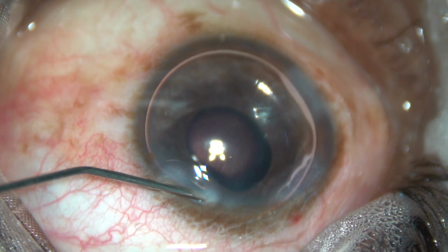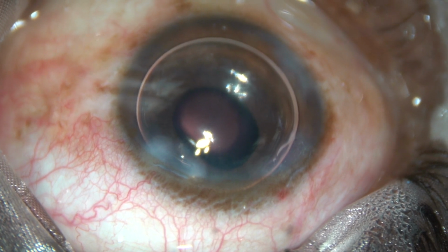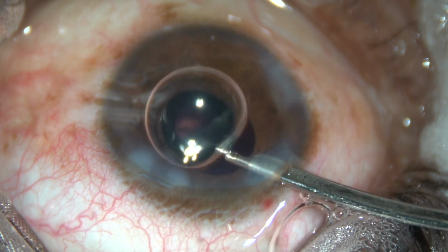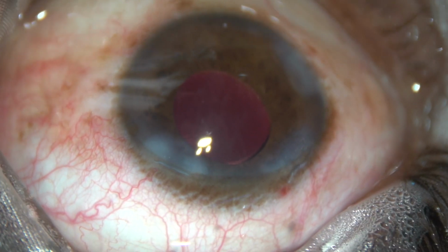Now these side ports are hydrated nicely. Final lavage of the anterior chamber is done and the case is concluded. Thank you very much. Hope this video will help you in developing your surgical skills, will help you in managing PC rents.